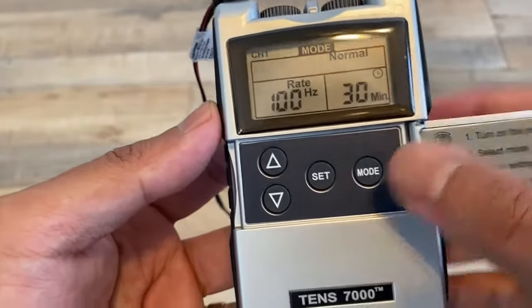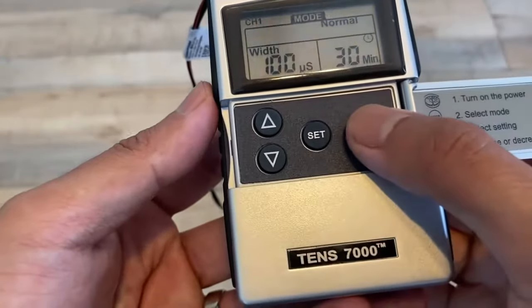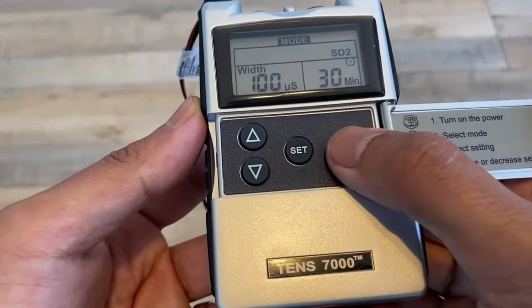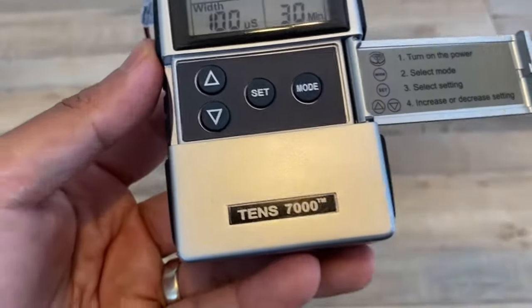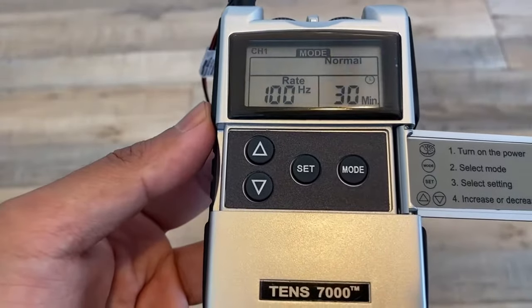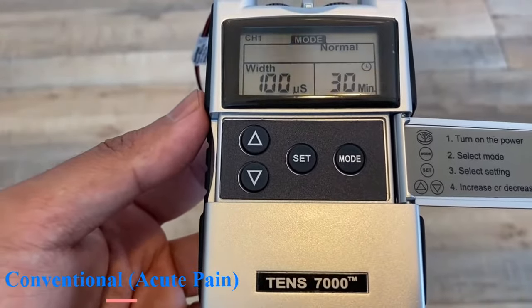If you toggle the mode button, you can see that it goes from modulation, strength duration 1, strength duration 2, to burst. We're going to start at normal, which is probably the most commonly used for acute pain. This is going to be a high frequency, low amplitude mode.